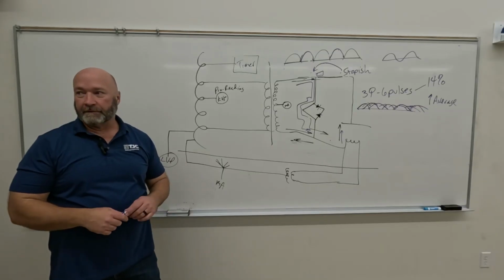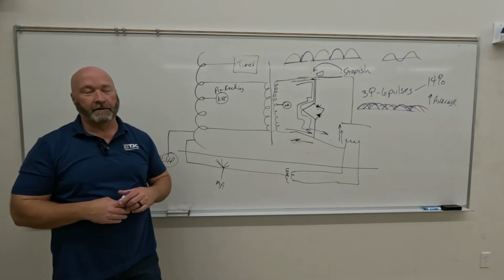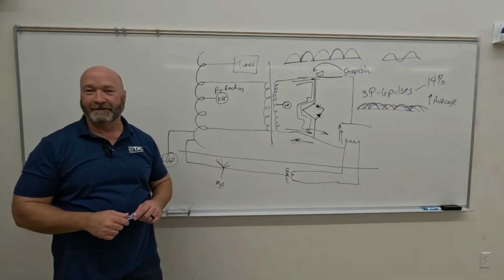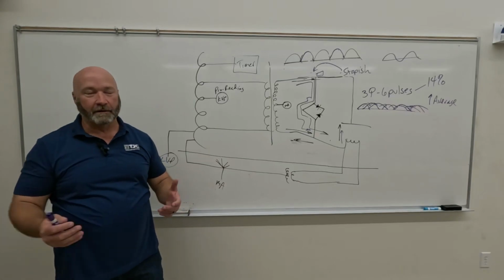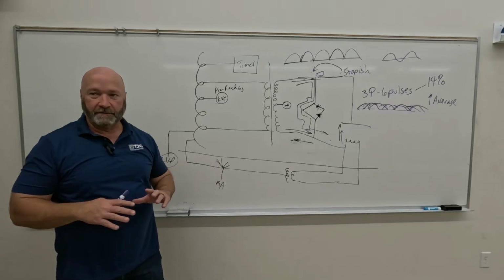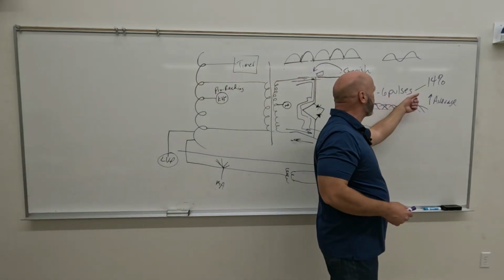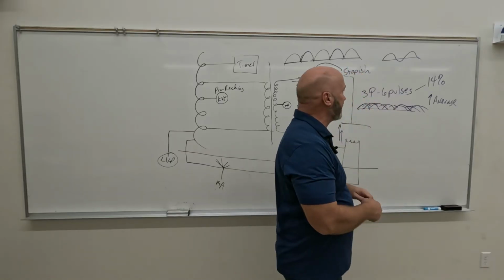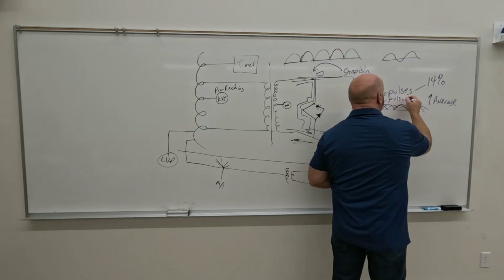Okay, everybody with me so far? Because I'm about to introduce 2 things that aren't going to make any sense at all. The first one is, you don't have to know how this works, and I'm not even going to cover how this works because it's just circuitry voodoo, but we can bounce those 6 pulses back and forth a little bit and actually get 12 pulse 3 phase.